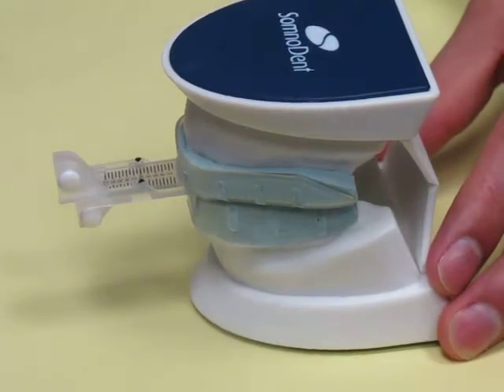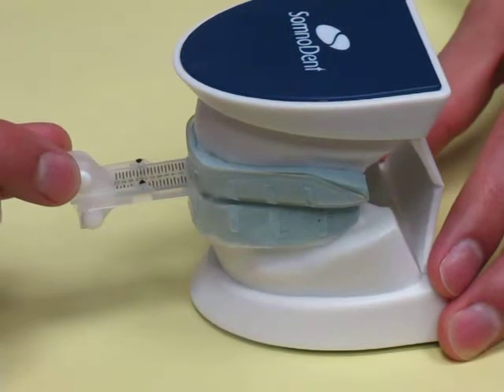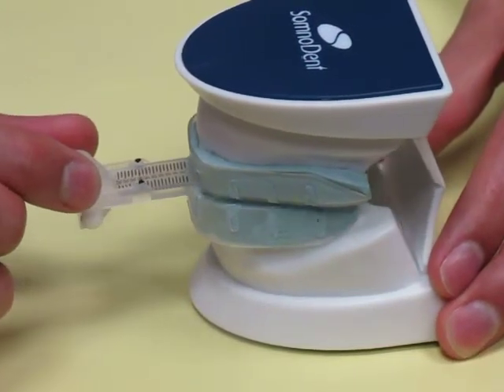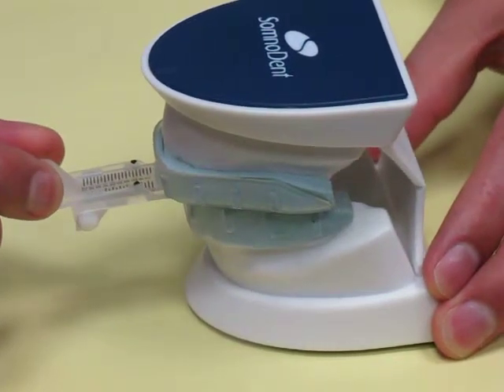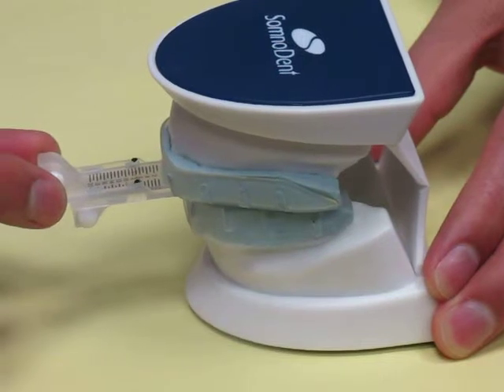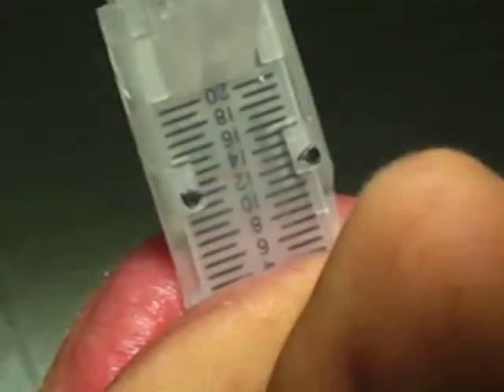The trays are mounted on this model to show you how easily the trays should move from edge to edge to full protrusion and then back to full retrusion. Now let's have our patient move the trays to full protrusion and retrusion and record the scale readings needed for the MATRx study. The scale readings needed to conduct the patient's titration study are the habitual bite position, the full protrusive position, and the full retrusive position.